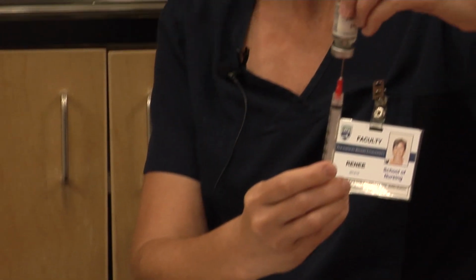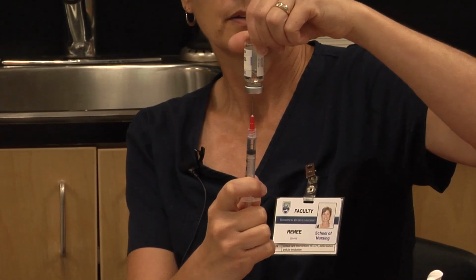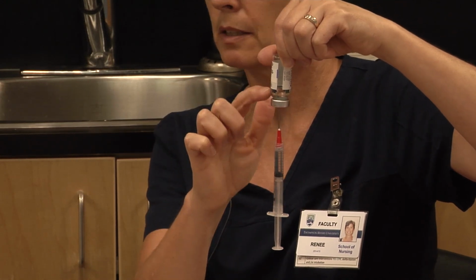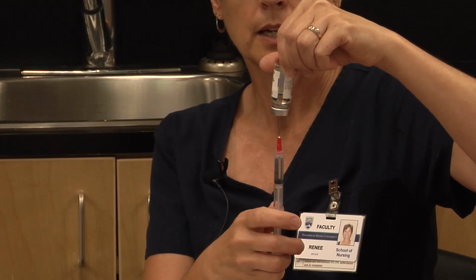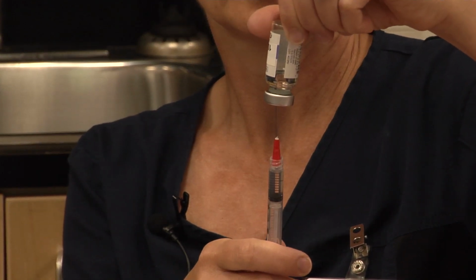Yep, and then we invert it. And I see you're keeping the end of the needle under the level of the fluid there. The fluid, exactly. Sometimes, if the pressure is high inside that vial, when you inject the air, you'll get a little bit of leakage out. That's okay. If you're allergic to the medication in there, that's not okay, in which case you would be wearing gloves.